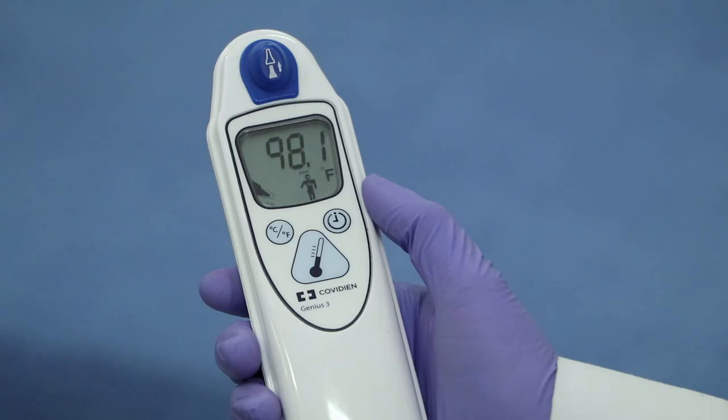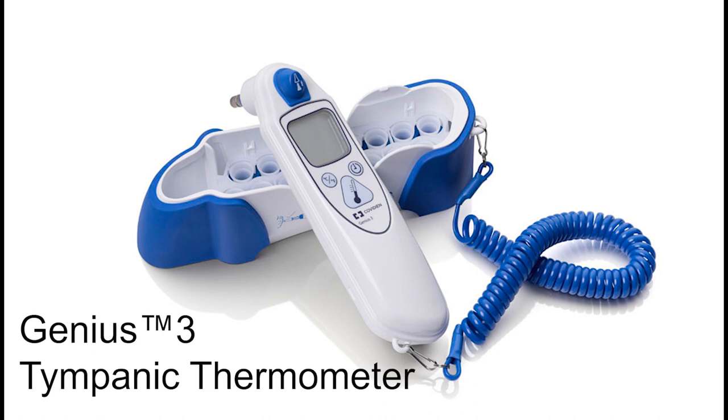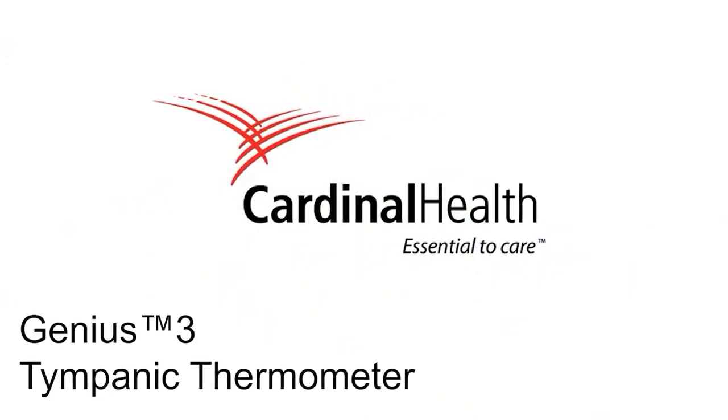With an accuracy claim of plus or minus 0.3 Celsius and plus or minus 0.5 Fahrenheit, you can rely on Genius 3 to meet the needs of your facility, paving the way for better patient care. Cardinal Health Genius 3 tympanic thermometer.